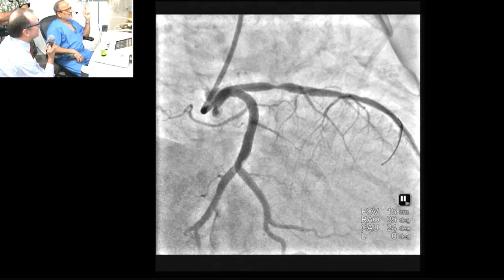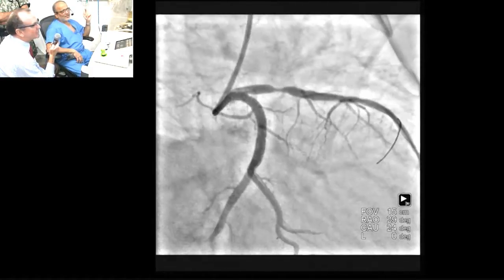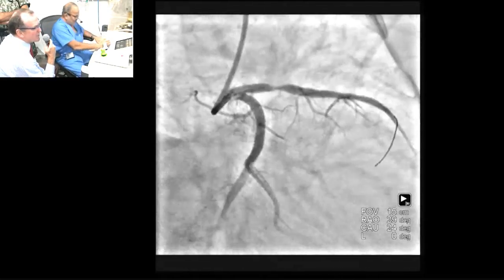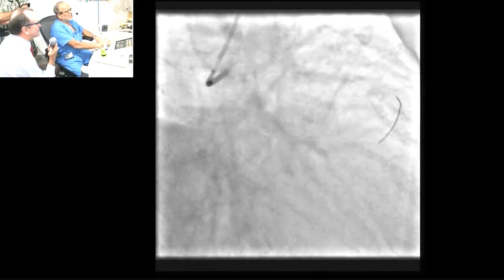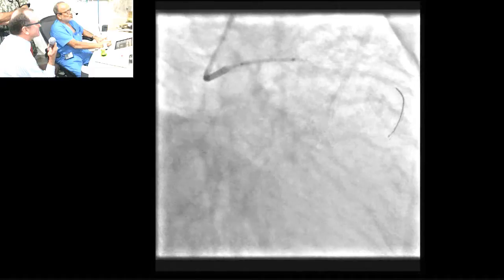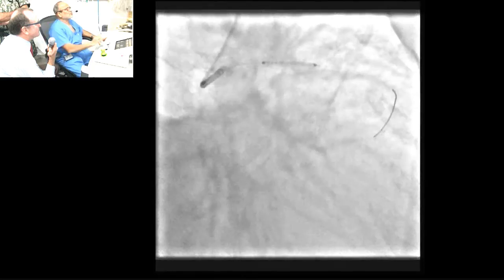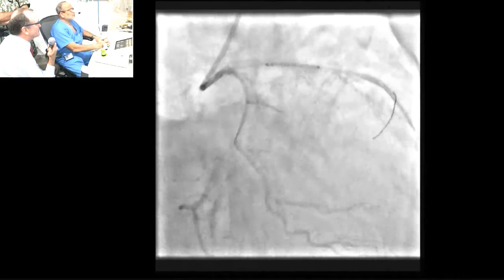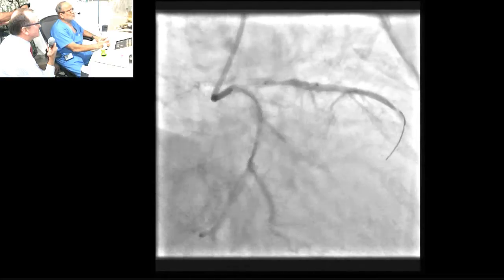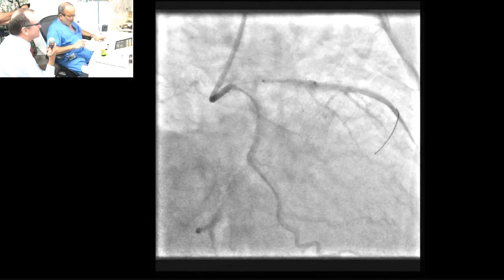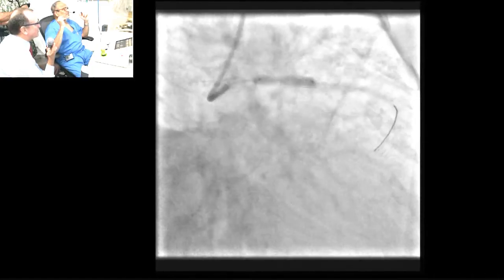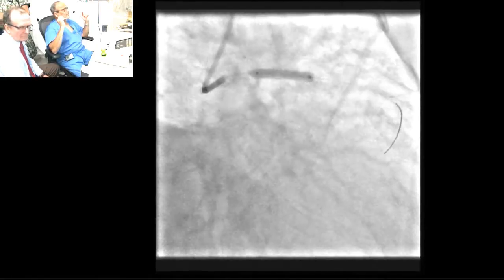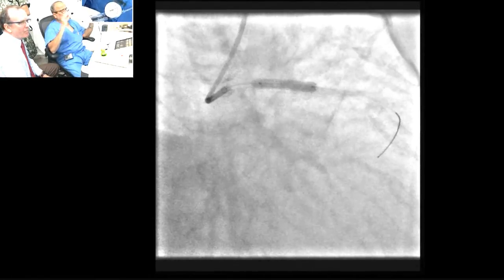Which stent have you taken, Sanjay? 3.5 by 18 — Xpedition. So this is going to be direct stenting? Direct stenting. This is a turbo; it goes very fast. Now I am slow. And there I am. Going up. 12, 14, 15. It looks good. Come down.